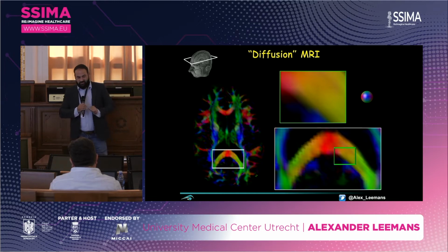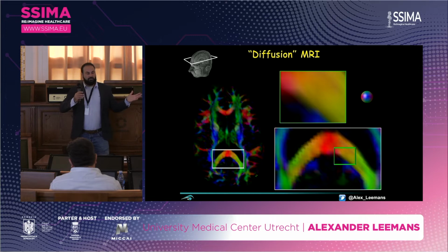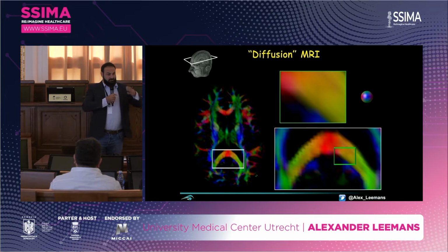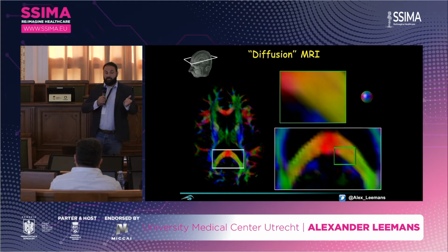Anyway, a side note. So if I look at this map here, everything which is dark, like for instance this area over here, well, there's no preferred orientation. If my water molecules can diffuse freely, what's my underlying tissue? CSF. It's just water, right? It's the cerebral fluid in which molecules can move freely. There's no preferred orientation. So what about the bright areas? Well, everything which is bright has a high eccentricity, cigar-shaped, a clear preference in the orientation of my diffusing molecules.